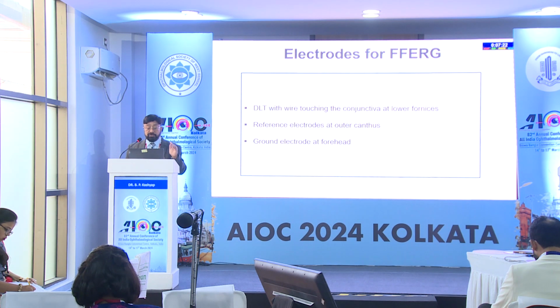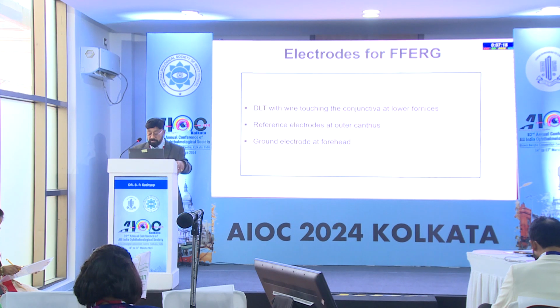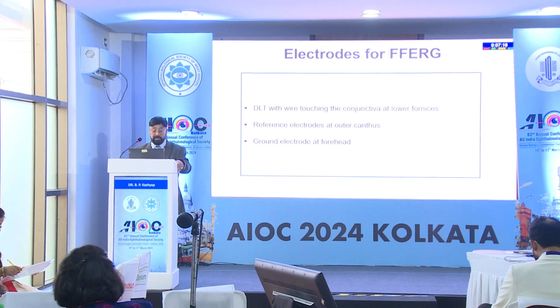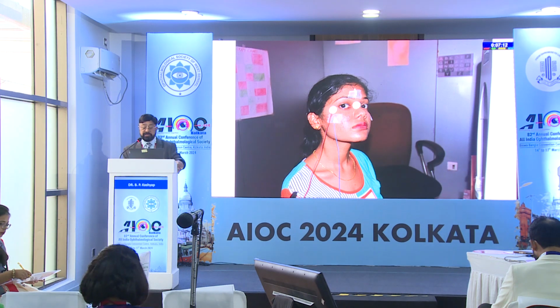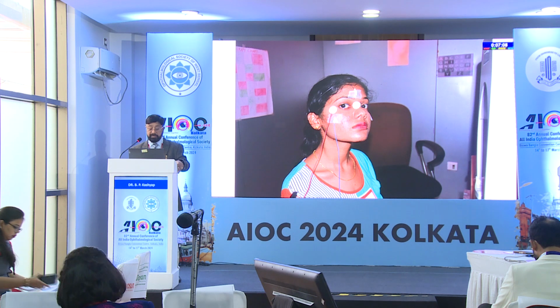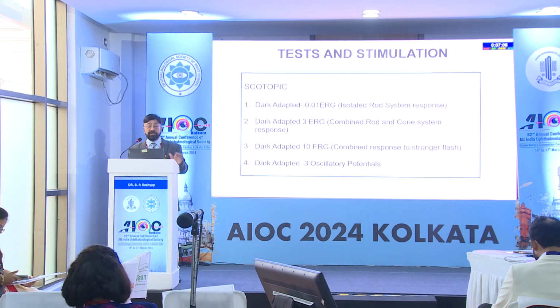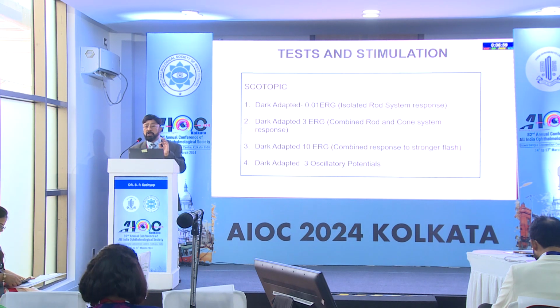So the electrodes for the full field ERG, like Dr. Rahul said, will be a reference and a ground, and the electrodes are like this. In both the canthi and the forehead is the ground electrodes. So the tests are scotopic, that is in the dark condition. In dark condition, when you throw a very small amount of light.